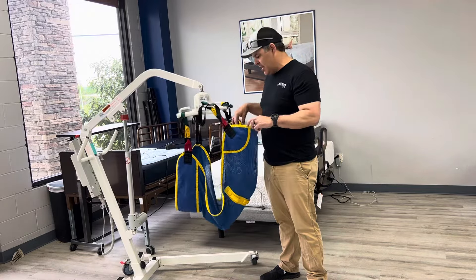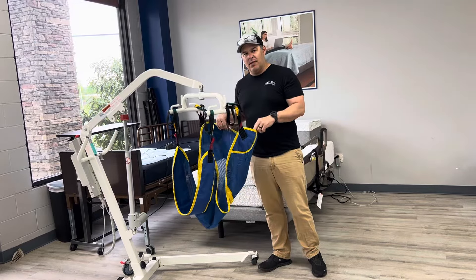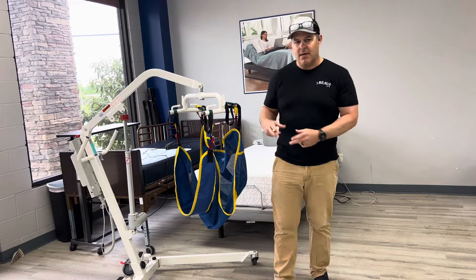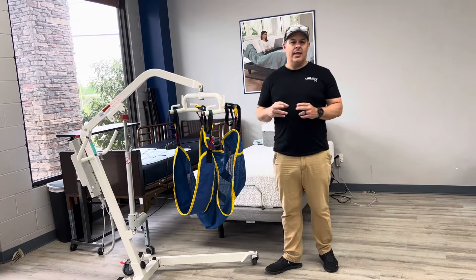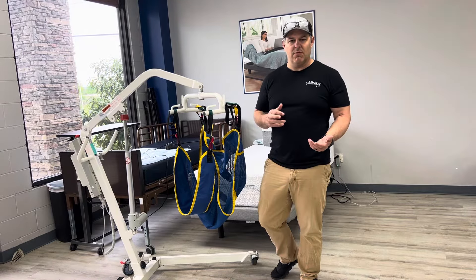This is the sling, and they make different versions of them. They make a full body sling, they make ones that wrap around individual legs, they make them with a commode cutout, and they come in different sizes — so you've got a couple of different options depending on what you're looking for.